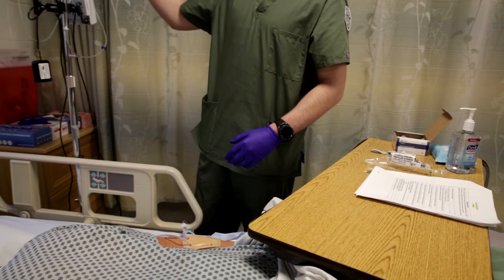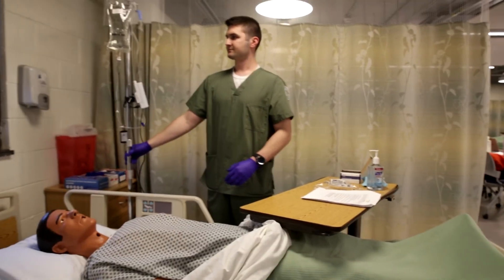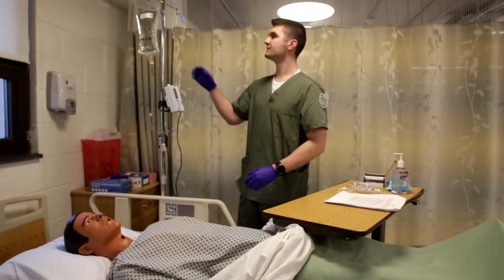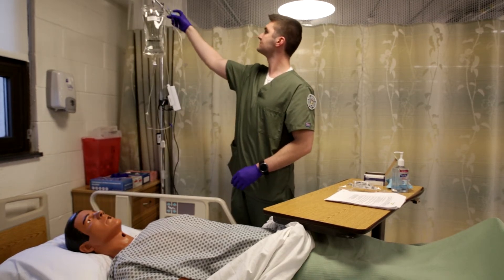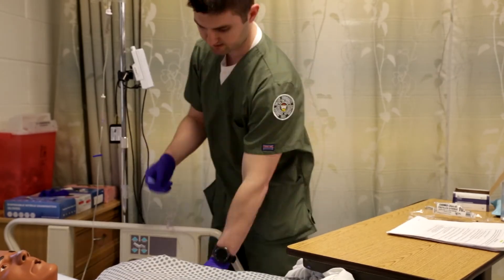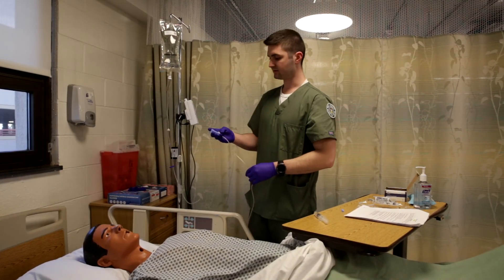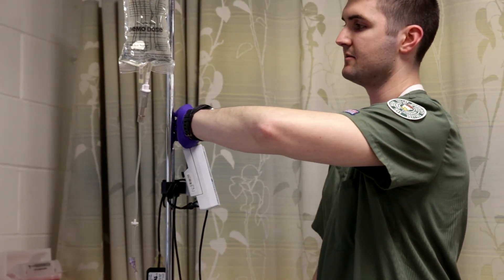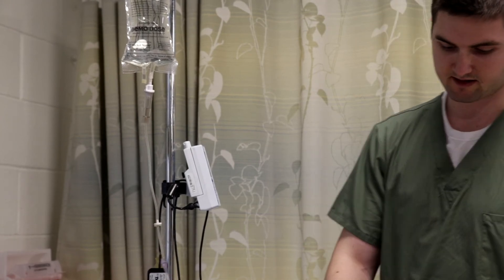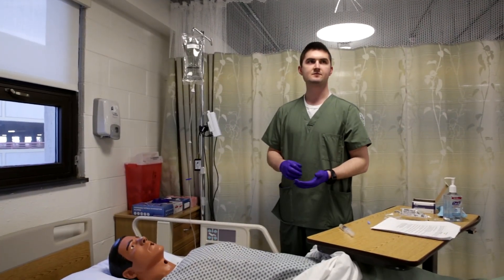I'm going to start working on my IV tubing. My order is to do 30 drops per minute. Using the roller clamp and your watch or a clock, time the drops so that you get the right drops per minute. I have my 30 drops per minute set. I'm going to reassess my site to make sure I don't have any signs of infiltration and there are no complications. I'm going to document and we'll be all set.